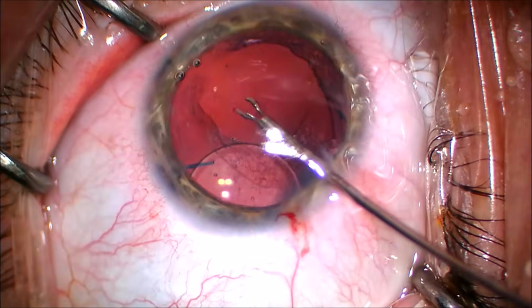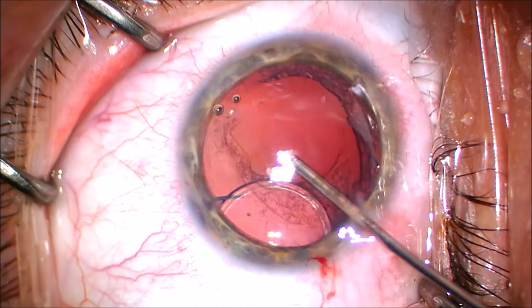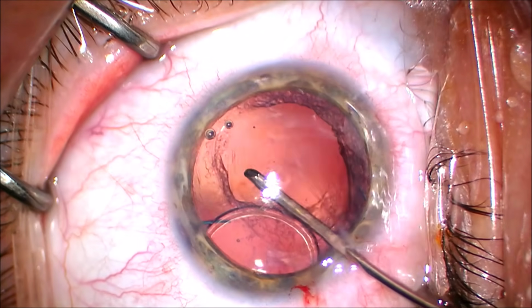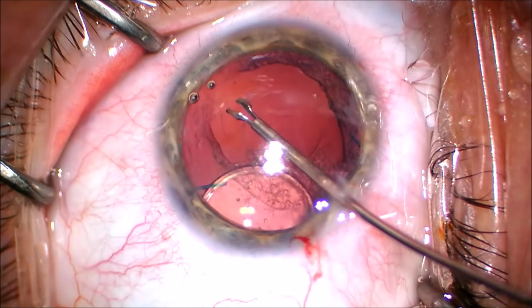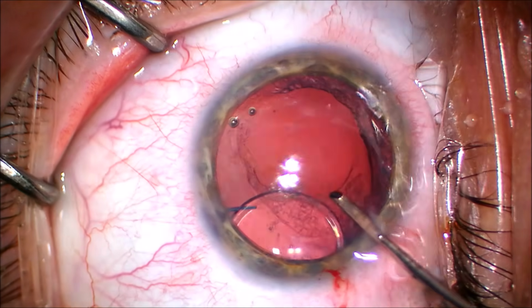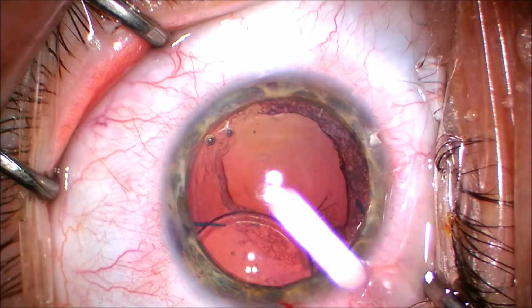Just trying to find the edge so it doesn't just run out on me. And again, because it's all mixed with the viscoelastic above and below, it's just hard to grab the edge of the flap of the posterior capsulorhexis. So there you go. I finished it.